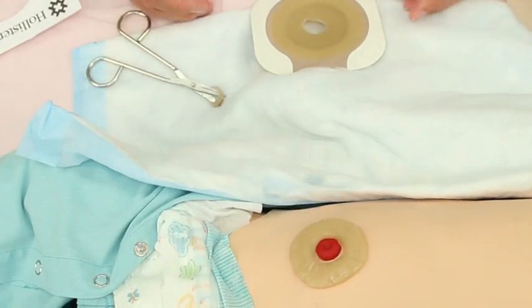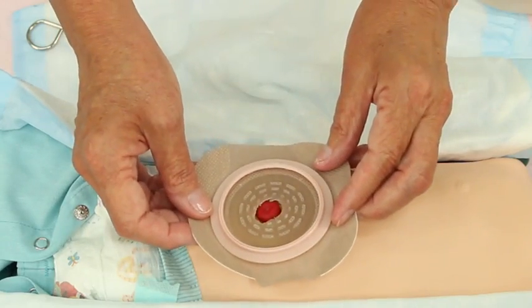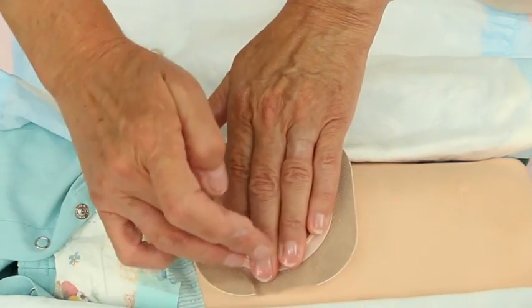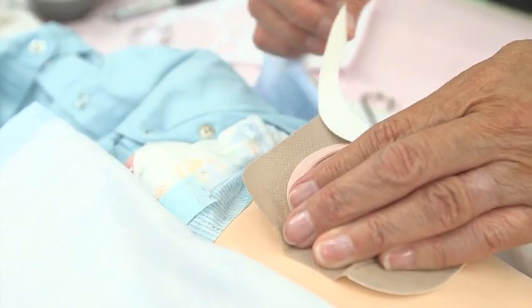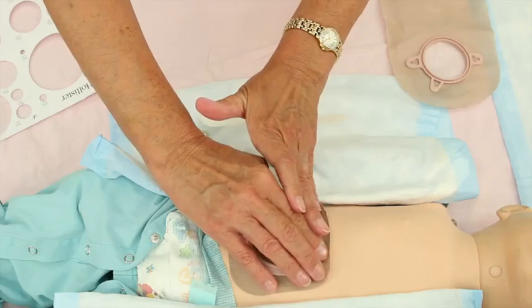Center the skin barrier flange opening over the stoma and press into place. Do not try and stretch it. Allow it to lie in place. It is okay to have a couple wrinkles. Remove the 2 strips of paper backing from the skin barrier flange.